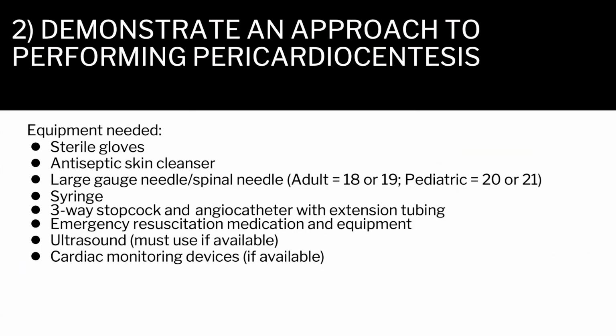The following equipment will be needed: appropriate personal protective equipment, including sterile gloves, antiseptic skin cleansers such as chlorhexidine, large gauge needles with trocar removed. 20 or 21 gauge needles are acceptable in a child, and 18 or 19 gauge needles are acceptable for an adult.